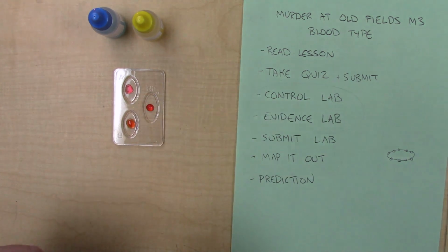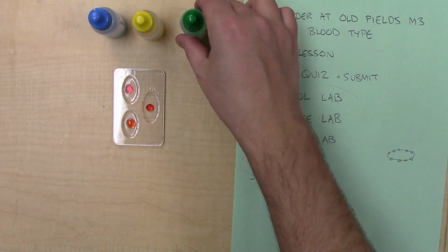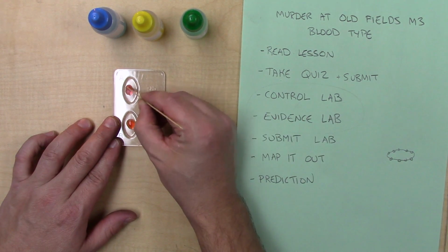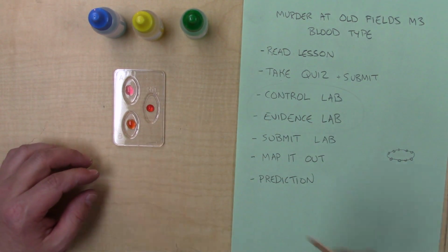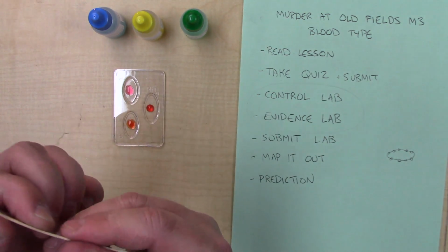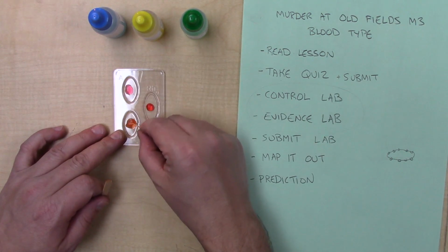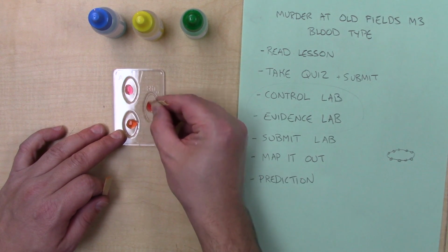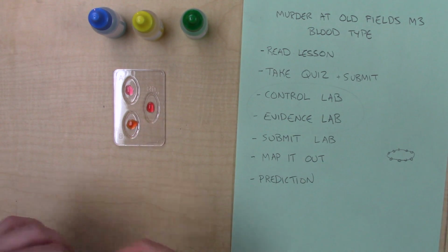Now, I let those sit for a second, and I can use a stick to stir them. Never use the same side. If you use that side, you need to either break the stick to mix the next one, or use the other end.